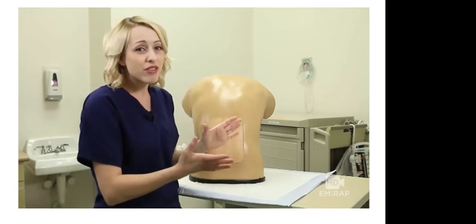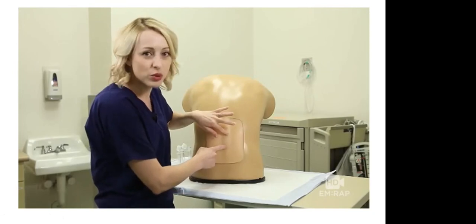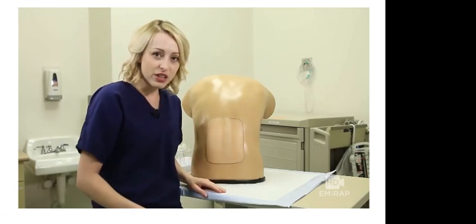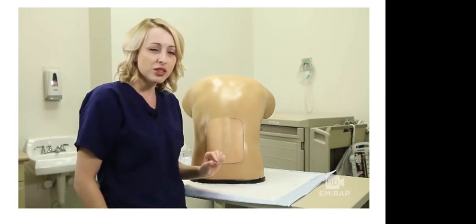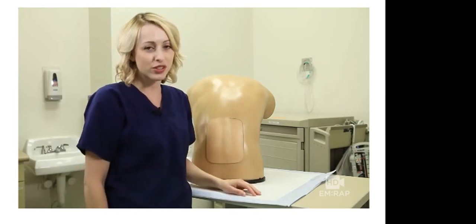Either way, you want to have them arch their back and flex at the hip, and that's going to increase the distance between the spinous processes so your needle can more easily fit through. If they're sitting up, you can have them rest their feet on a stool, and then they can rest their head and their arms maybe on a table in front of them. Now, you can also consider giving them a little bit of benzodiazepine to help them through the procedure.